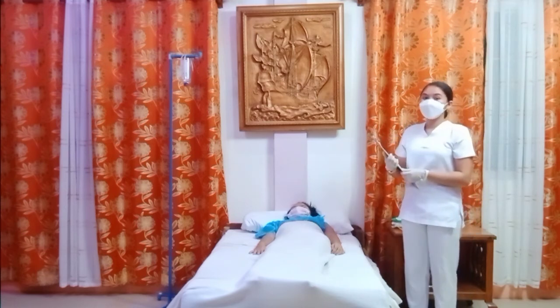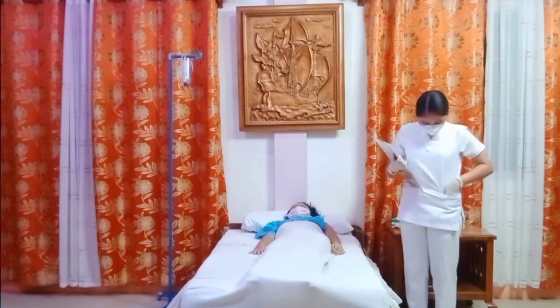Lastly, document the temperature results in the patient record.